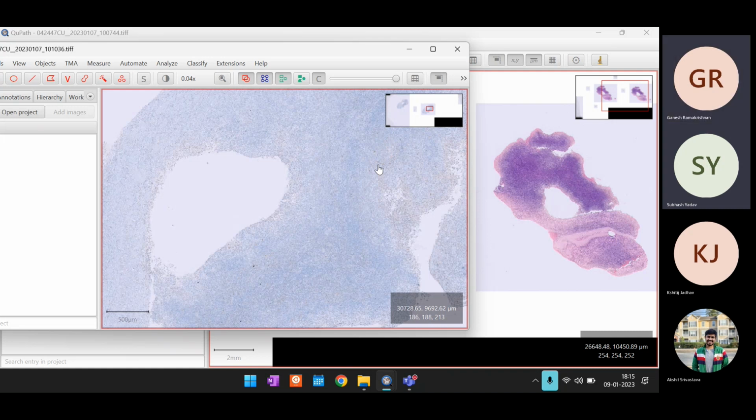Okay, this is the microenvironment, and these are the subclasses. So this belongs to lymphocyte rich or depleted or whatever. That will help us give a complete report: there is a Hodgkin's lymphoma, and it is of this subclass, so this is how the patient may behave. That is the ultimate goal we want to reach.